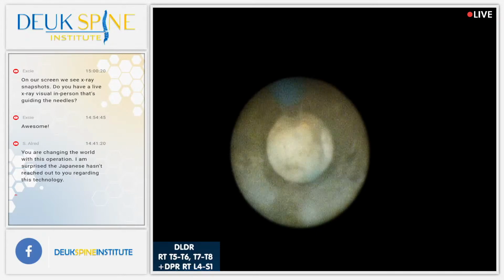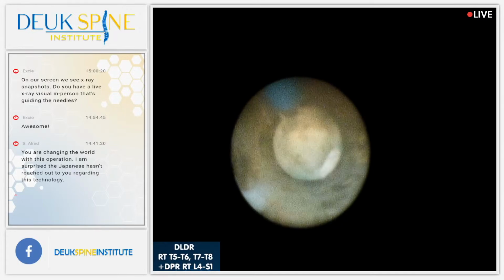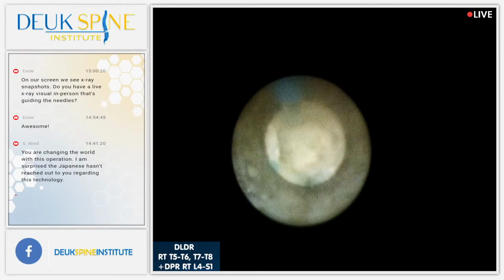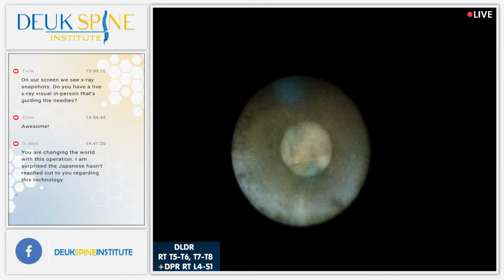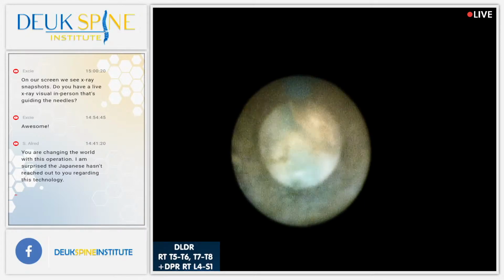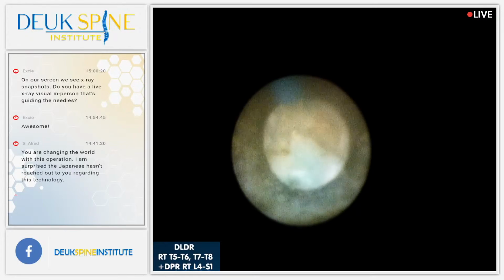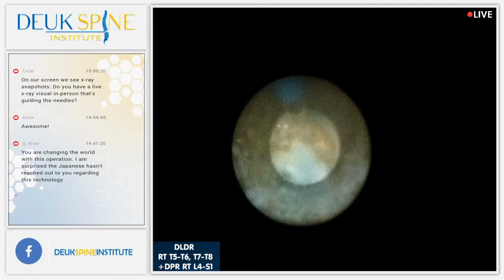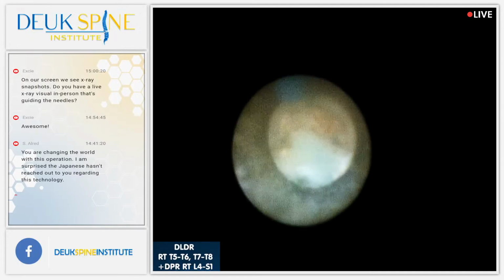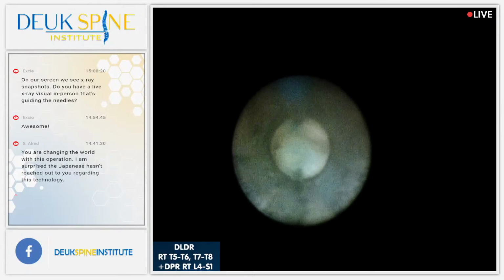And for those of you who don't know what that is, the nucleus pulposus is the center of a disc. It's like a hydraulic semi-liquid solid. So it's not a solid like hard, but it's semi-fluid. And when you get a tear in the wall of your disc, called the annular tear, which is what I'm cleaning right now with the laser, the blue stuff, the nucleus, comes up into the tear and causes inflammation. And it's the inflammation that's so painful for these patients. It's the inflammation that causes all the pain. So if you can get rid of the source of inflammation in the disc, you can get rid of the disc pain.